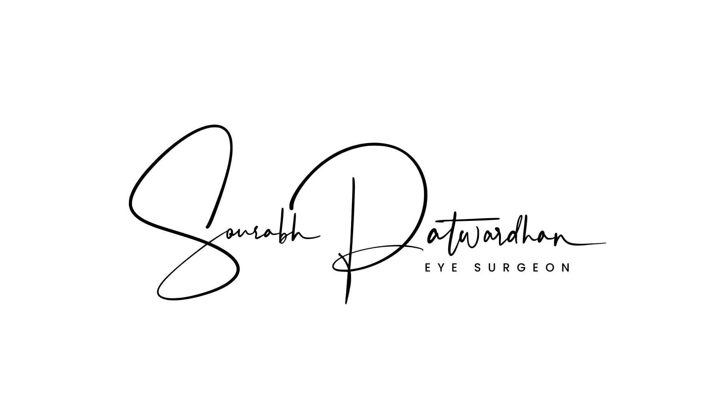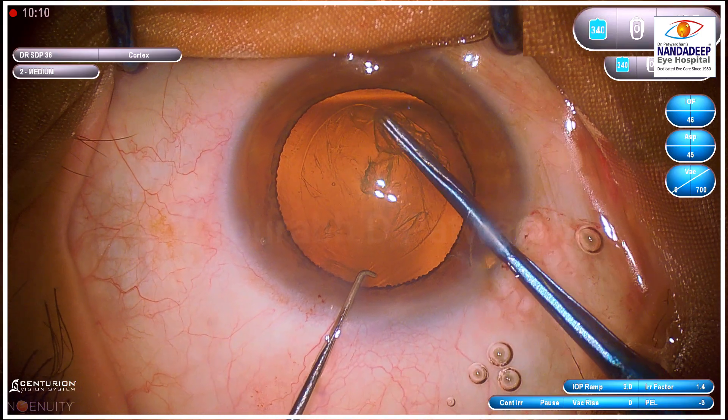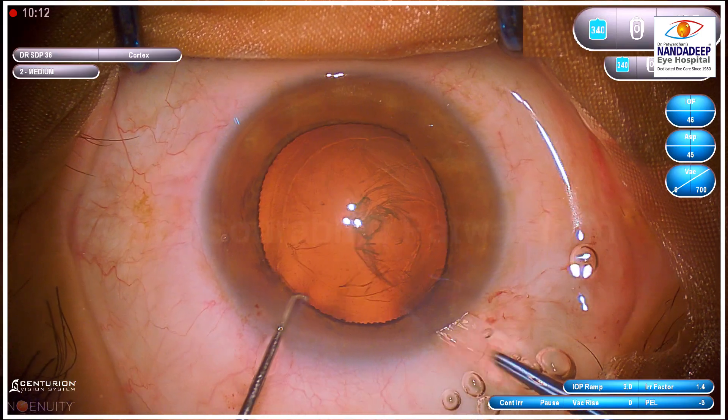In this video, I am going to show grade 3 cataract which is considerably harder, and I have used the technique of phacoaspiration where I am not going to do any chops or divisions. I am going to phaco and aspirate the nucleus into two.